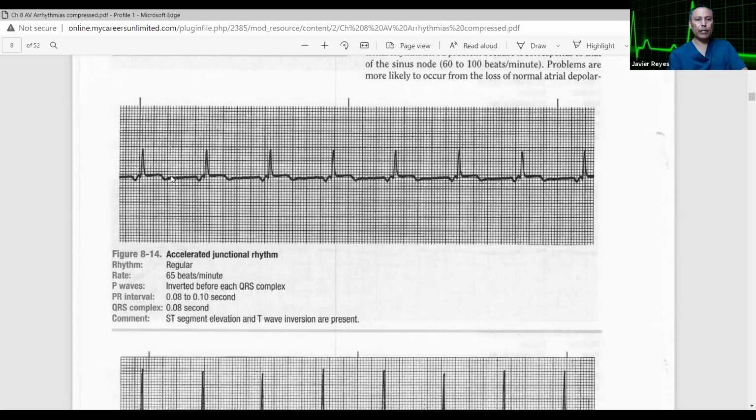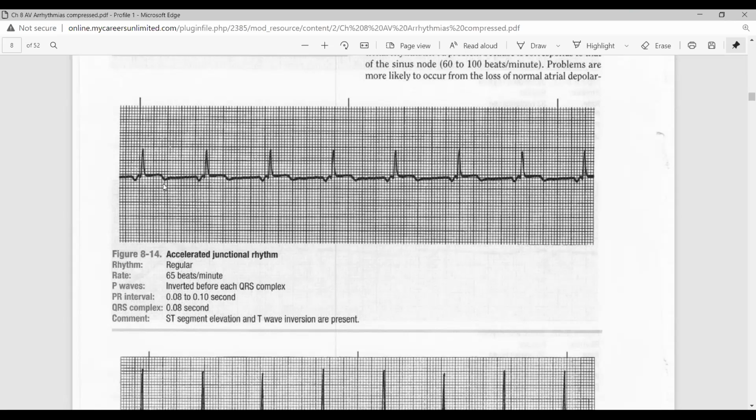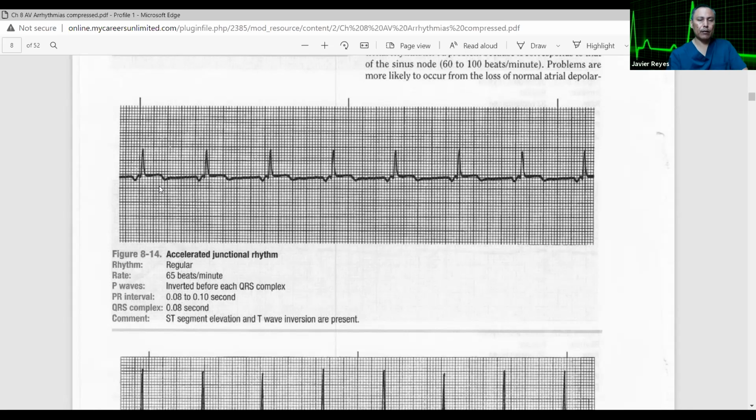And then you have your T wave. Your T wave is inverted. T wave inversion. It's also backwards. Why would you have a T wave? What is the T wave? What does it represent? It represents ventricular repolarization, right? The refilling, restretching of the ventricles. This one should be pointing up, but it's inverted. Why do you have deflection, like signals coming back up?